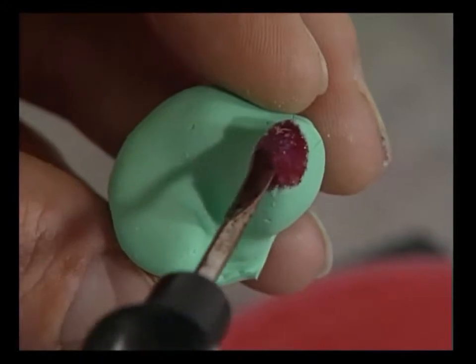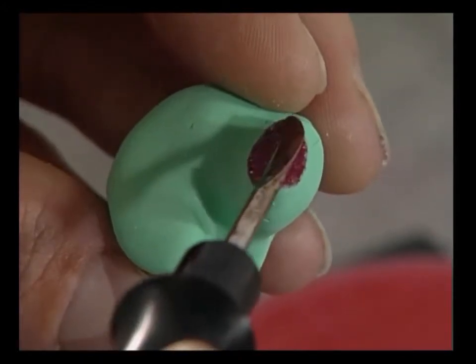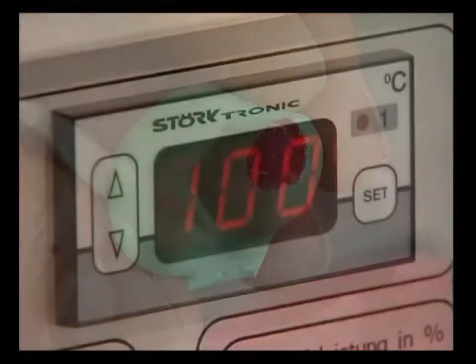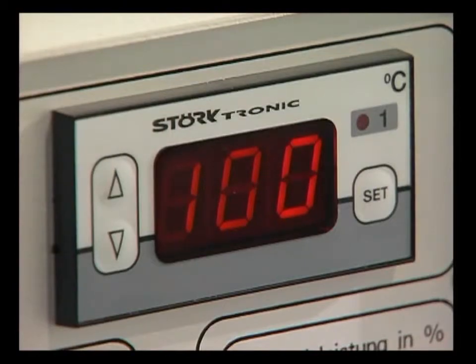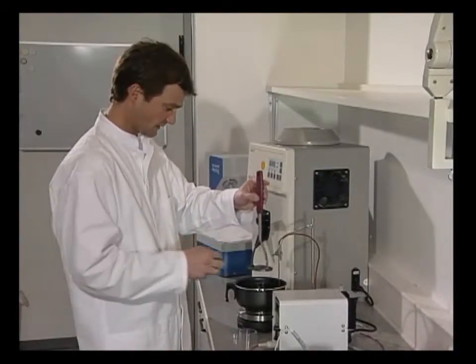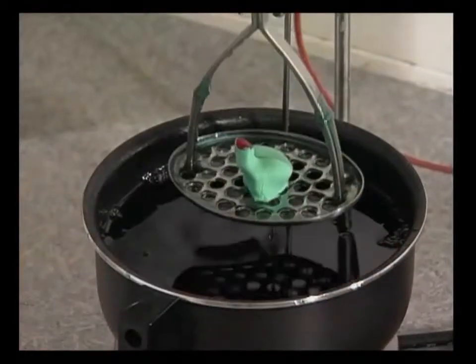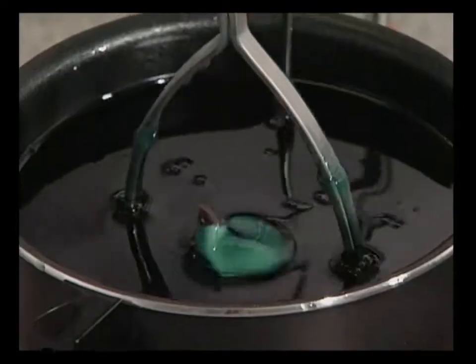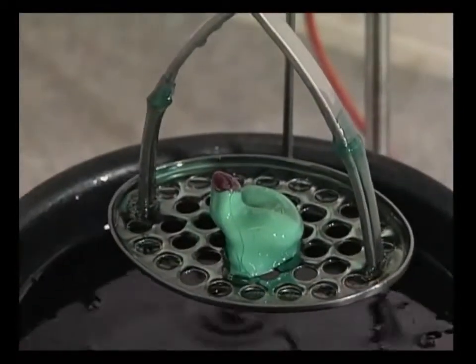The temperature in the electric wax immersion unit is maintained at a consistent 100 degrees Celsius. The impression is placed in a dipping sieve and dipped vertically into the liquid wax. The impression must be completely covered by the dipping wax.